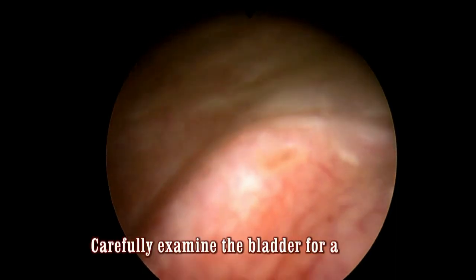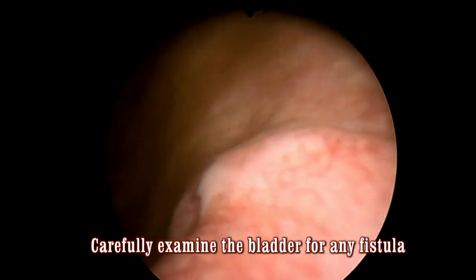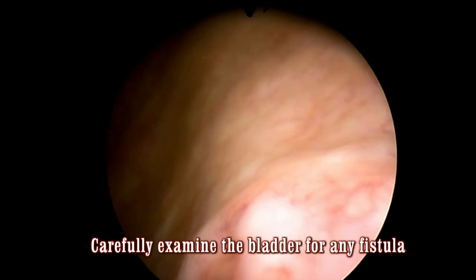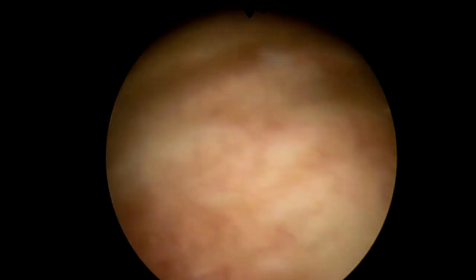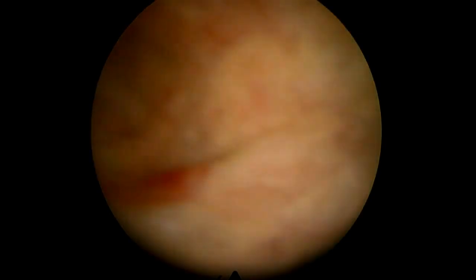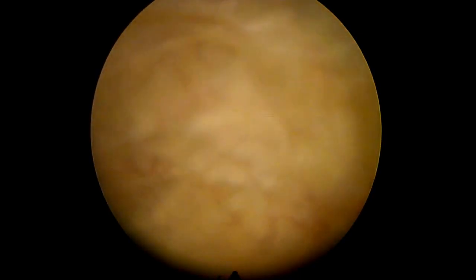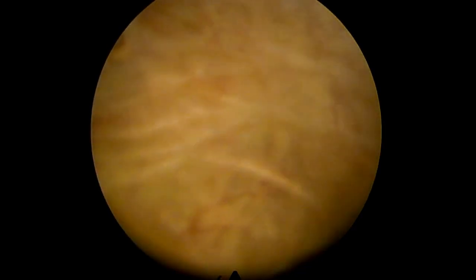First of all, you examine the urinary bladder cystoscopically and thoroughly. See the area of the left ureteric orifice, the trigone of the urinary bladder and bladder neck, and the right ureteric orifice. Spend time to see the efflux of urine coming out of each ureteric orifice. Examine the right lateral wall, the posterior wall, the left lateral wall, the area of the high posterior wall, and the dome of the urinary bladder. The dome can be identified by the presence of air bubbles.